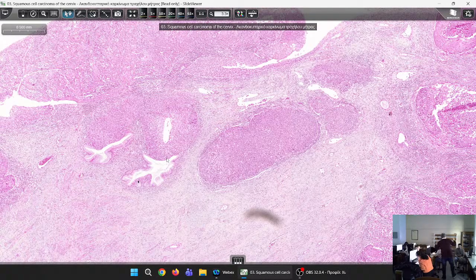So, in case we have dysplasia, and particularly high-grade SIL, what can happen? The metaplastic epithelium, which appears to be in the lamina propria, may become dysplastic, as the surface epithelium, affected by high-grade SIL.